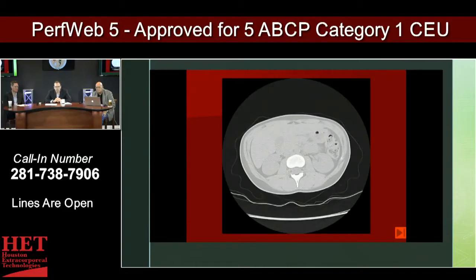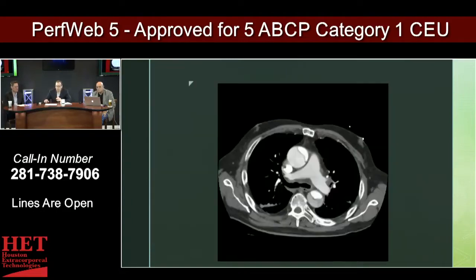The difference between this and chest x-rays is obviously the degree of resolution and the specificity and sensitivity. This gives you an entirely different amount of information. So this is a contrasted CT scan of the chest — I say it's contrasted because the vasculature is bright.